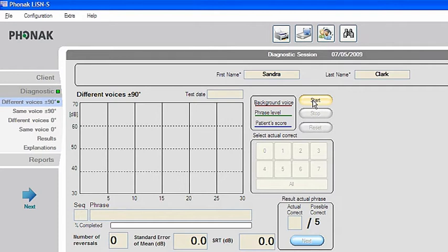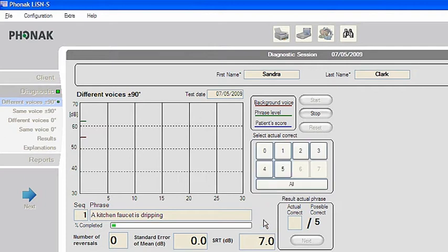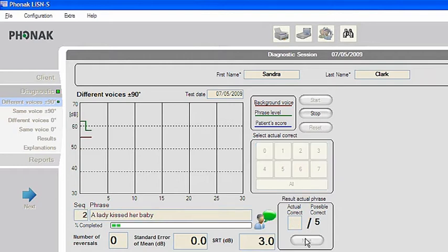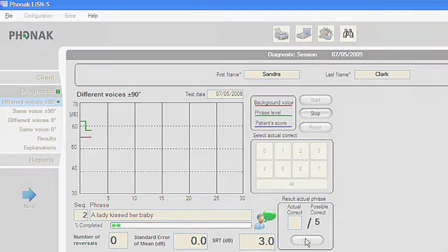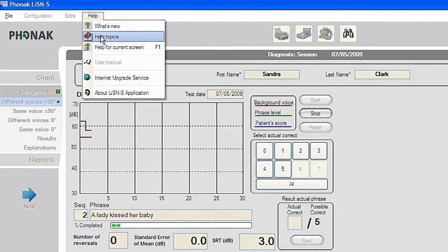When performing the test you will also see the level of noise and the level of the presented target sentence, the sentence being played to the child, and a box in which you must enter the number of words that the child repeated correctly. A word is considered correct if it is repeated exactly as it appears on the playback screen. If the child includes an extra word, there's no penalty. However, if the child substitutes a word, leaves a word or words out, or inserts morphemes such as plural or past tense markers, the number of correct words should be adjusted. In the user instructions, which can be found in the help menu, you can see an example.